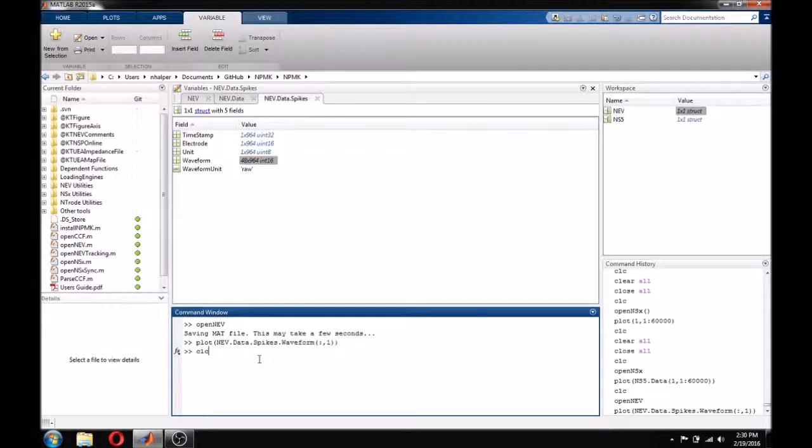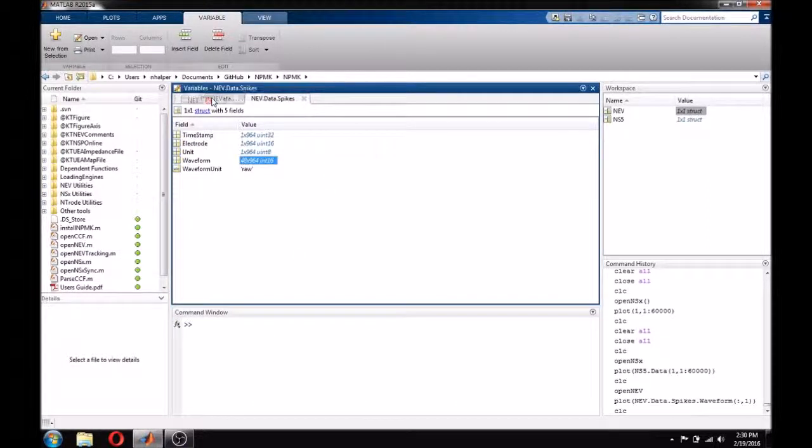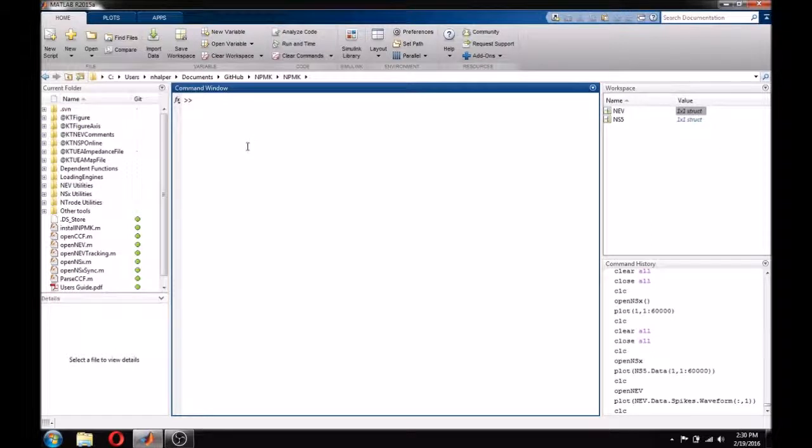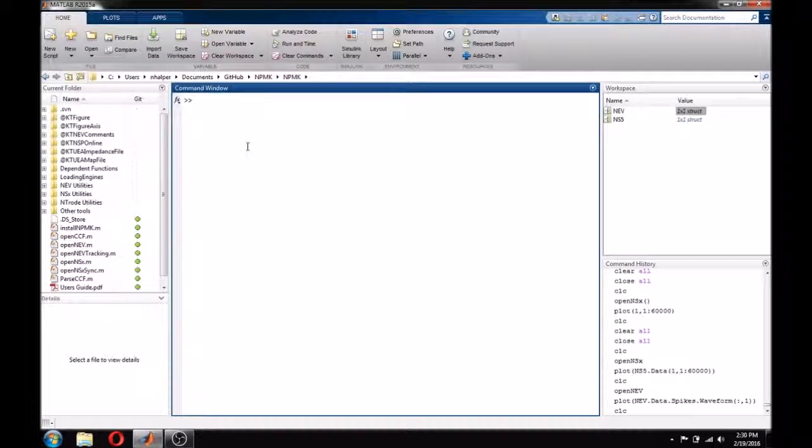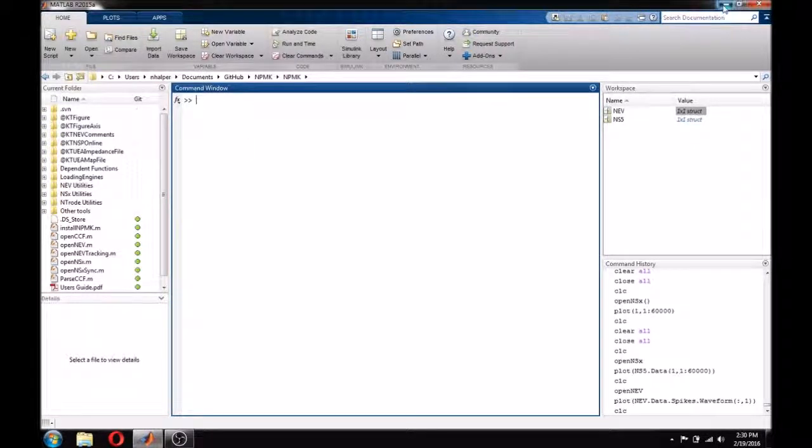That finishes the basics of using OpenNEV and OpenNSX, the primary data loading functions for BlackRock data into MATLAB. Thank you for joining us today for this tutorial, and be sure to check out our other videos for quick tutorials on many of our products. For additional information on any of our products, manuals can be found at www.blackrockmicro.com.